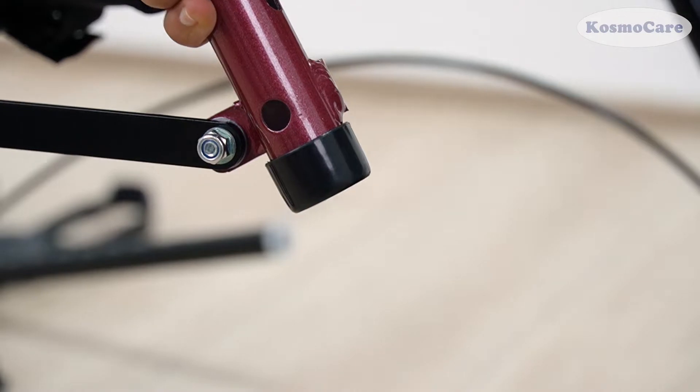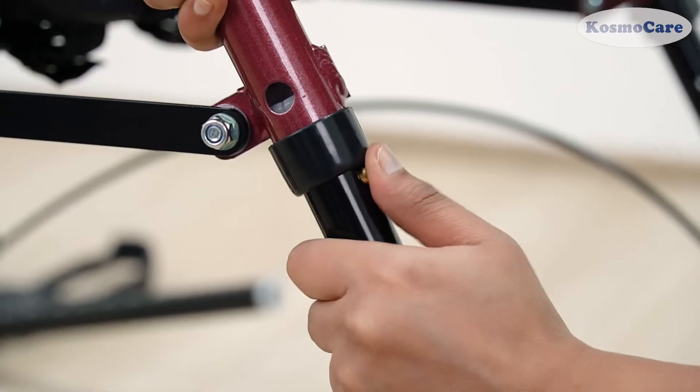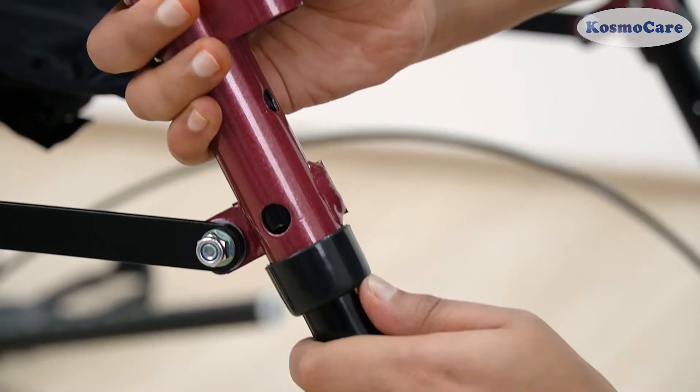Attach both rear legs with brakes using the same process, making sure the wheels are on the outside of the rollator and are at the same height as the front wheels.